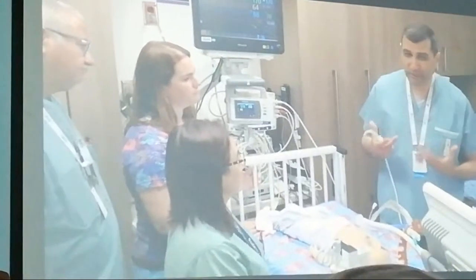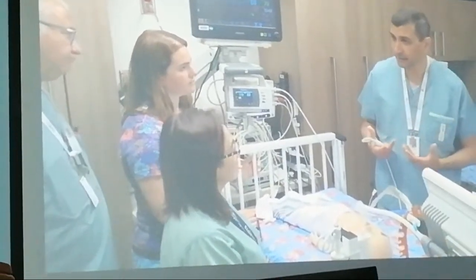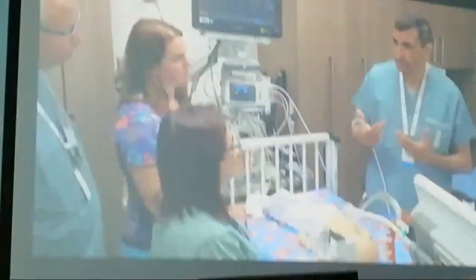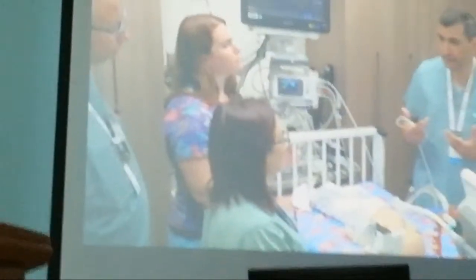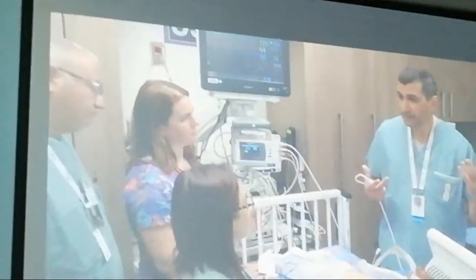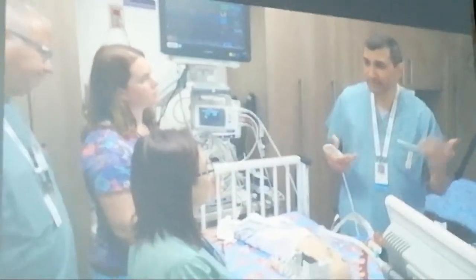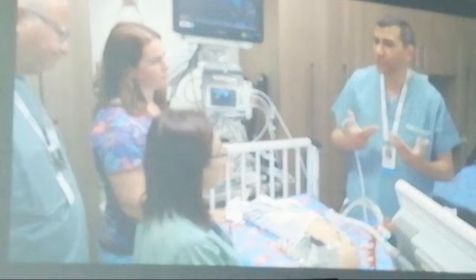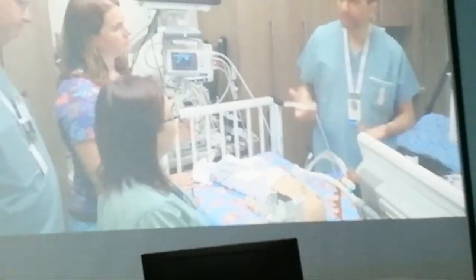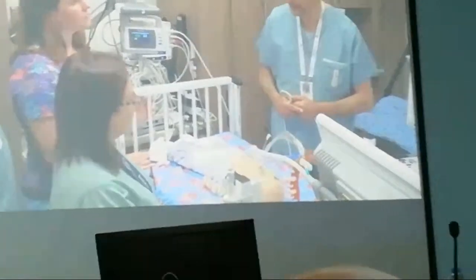Because when you have significant lung collapse, the lung is under-recruited, then the blood could be shunted from the right side to the left side through the lung without getting enough oxygenation. So whatever you increase the FiO2, even to 100%, or we need 60 or 70, you will not get a significant change in the cardiovascular situation, which already happened when we did the oxygen reduction test.